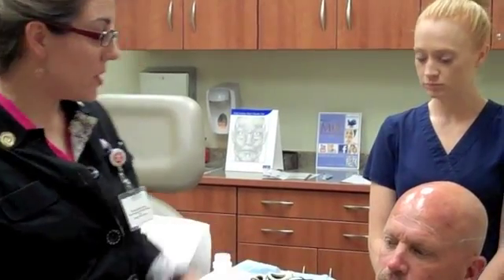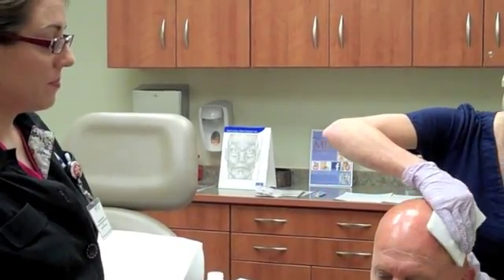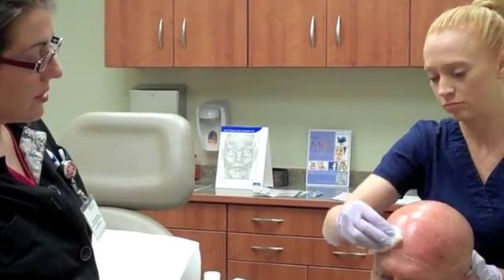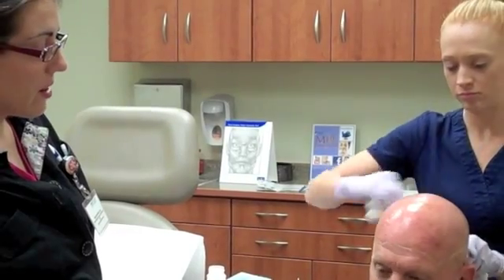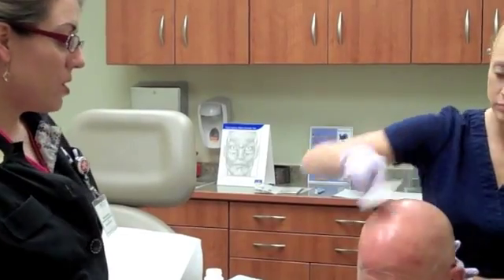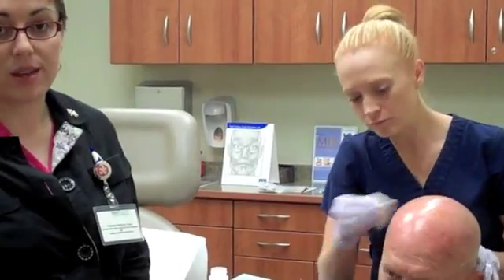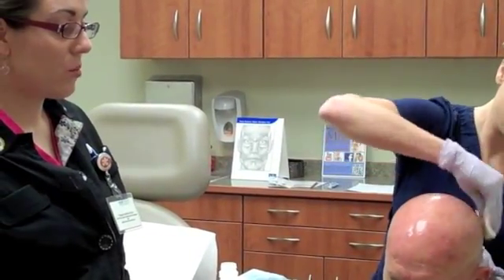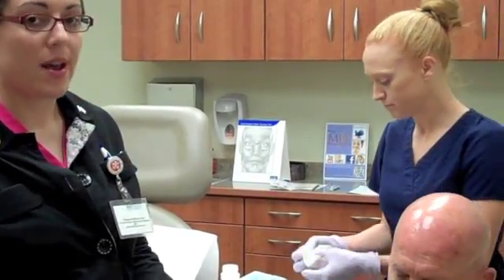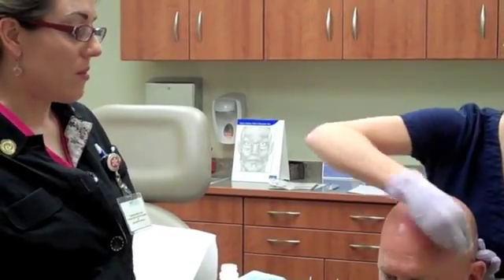So what we are going to first do is wipe off the skin — get all that numbing cream and amino levulinic acid off of the skin. Now when you have this treatment done, your provider will give you some goggles and it is very important that you wear these. Blue light, when you are exposed to it up close, can potentially cause some eye damage, so we want to have you wear your goggles, and the rest of us will be wearing some protective vision goggles as well.